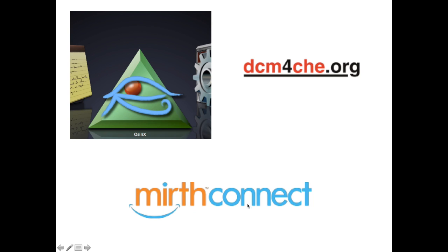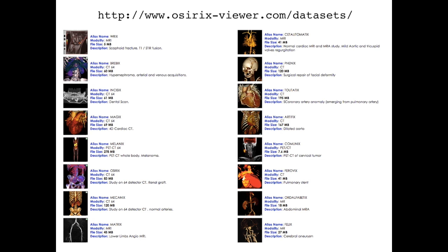And then finally, remember in the center of the diagram, the interface engine. There's an open source project that's also a product called Mirth Connect, which is an open source interface engine that you can download and play with on your computer. And in addition to downloading OsiriX, even if you don't want to download OsiriX, they have quite a few freely available DICOM data sets so that you can start to have a little bit of data to play around with. It's not patient data.